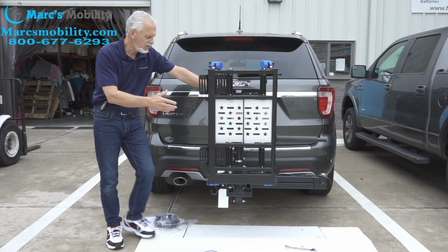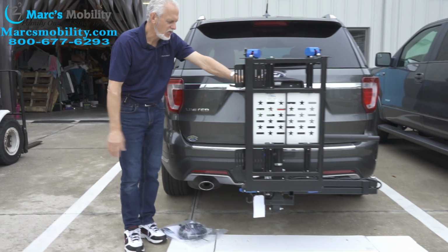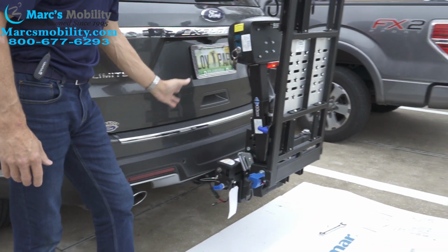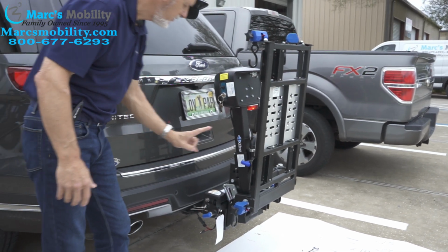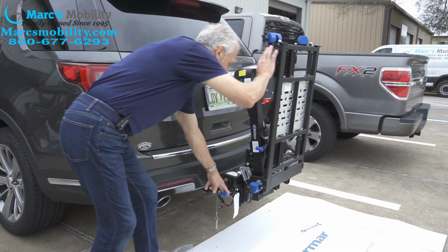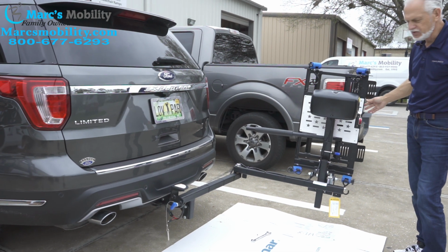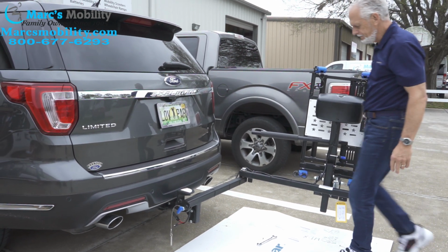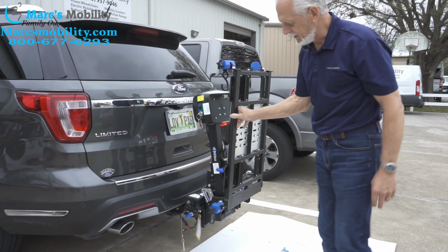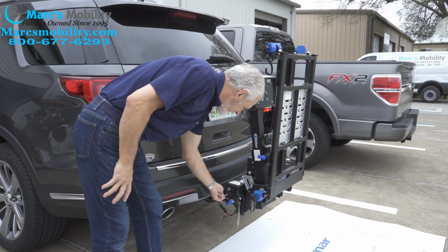So the first thing I'm going to show you about the lift is the swing away. Most of these lifts, you'll need a swing away to get in the back of your car. So before you put your chair on the lift, if you want to swing the lift away from the car, there are 2 things you have to do. You have to pull the safety pin out, pull the blue handle out, and then push your lift out of the way without the chair on the lift. Okay, so this is called a swing away. When you shut it, it shuts automatically, and then you put your safety pin in here.